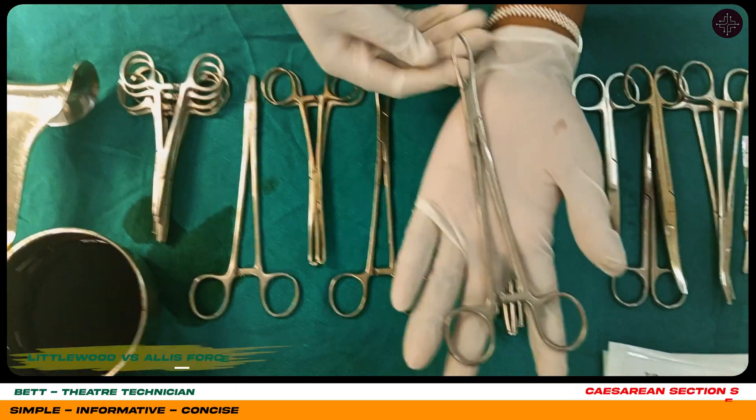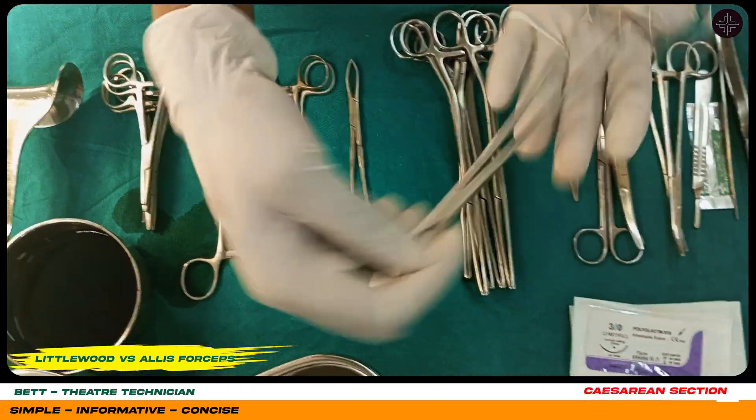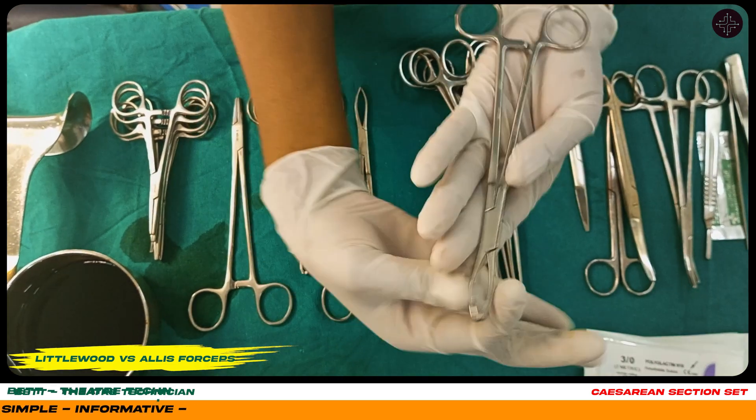This is a Littlewood, as you can see. People confuse it with Alice forceps, but to make a difference, I say the Littlewoods are hippy — they have hips.